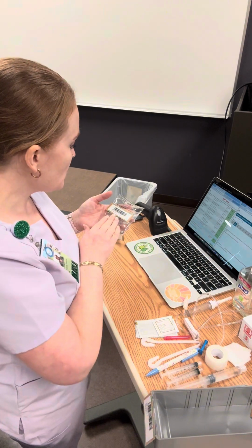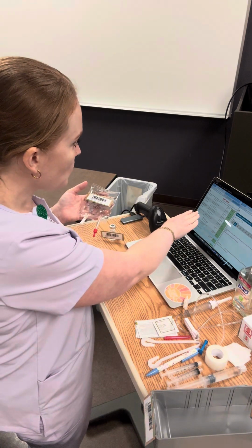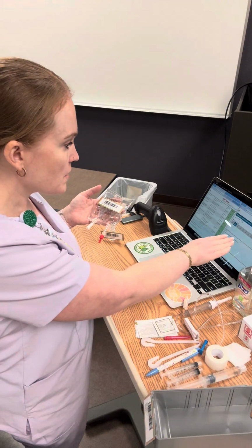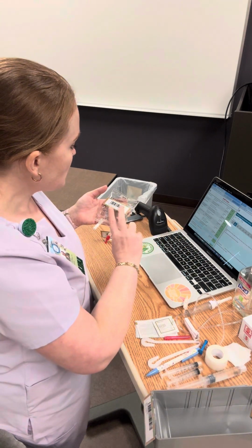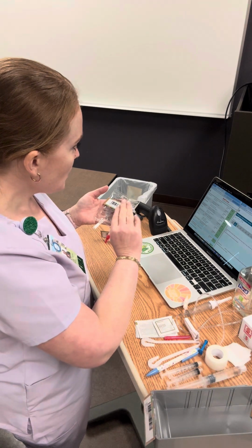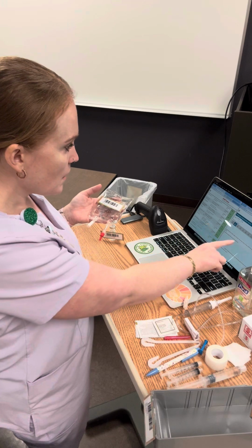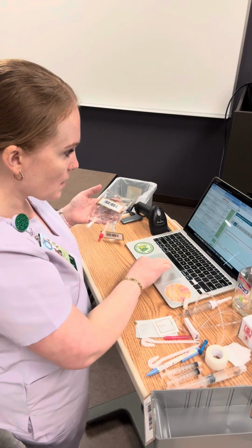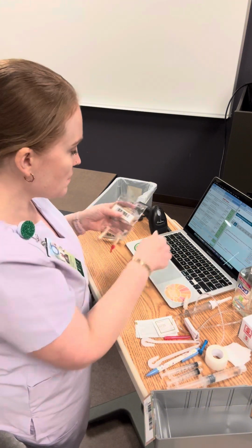The dose is going to be 500 milligrams per 50 mL. On my orders, it says 500 milligrams. And on my MAR, it says 500 milligrams. So we have the right route, dose, medication, and the right time is going to be given at 7:14 a.m. And that's my orders. On my MAR, it says 7:14 a.m. Click more details, and I'm looking at my watch.